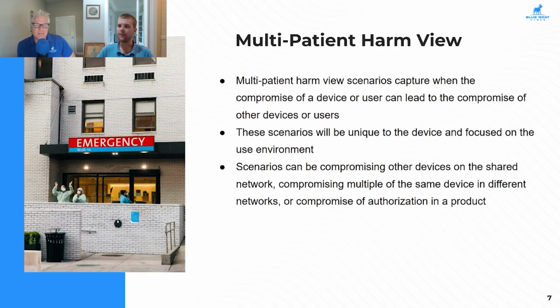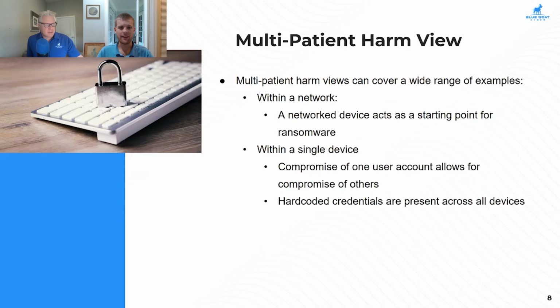That is a little bit of a difficult situation to cover. Oftentimes, it just requires expertise in the security space, understanding how similar vulnerabilities have worked in the past. But there can be some characteristics of specific attacks. I'll jump over to the next slide here where we have some of these examples. And I'll actually start at the bottom and we can work our way back up. So hard-coded credentials, for an example. This is something we see in, I would say, 80+% of devices that would be a multi-patient harm scenario.